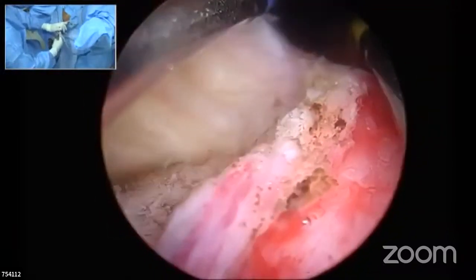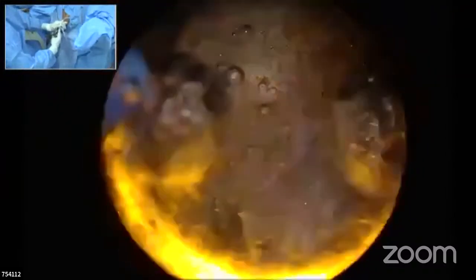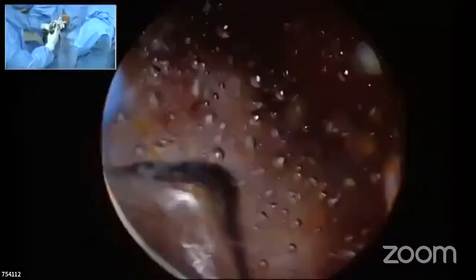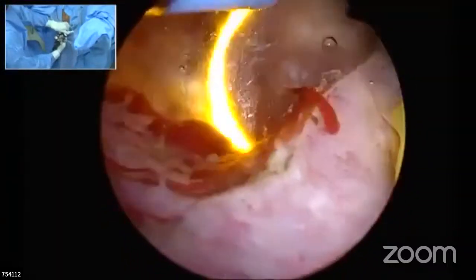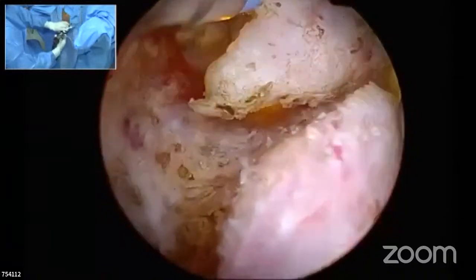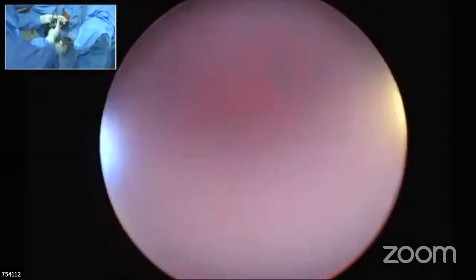So what I'll ask them to do is, after creating a groove, resect it immediately and flatten it. That's flatten it, right? And again, once you go back, come to the next level, next level again. So you will not allow the hanging lobe there. You will be resecting the lobe immediately, so you will not be lost in the groove. That is my way of doing it.